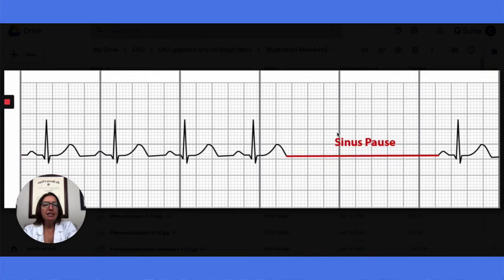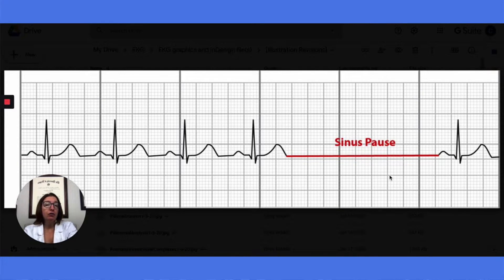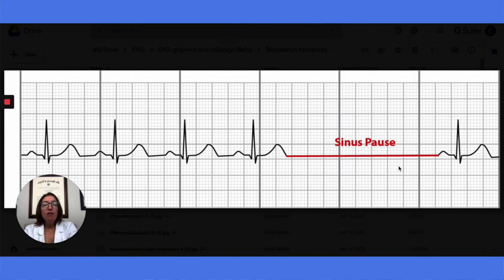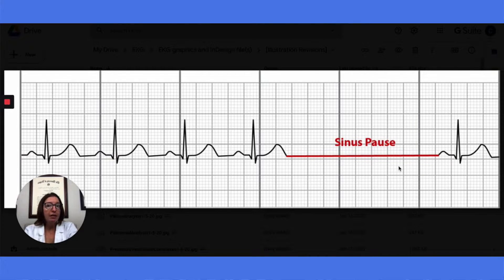Here we have a sinus pause, which is another EKG abnormality to be familiar with. A sinus pause is caused when the SA node fails to initiate an impulse, or that impulse somehow becomes blocked such that the atria do not depolarize. During the sinus pause, we will not have the P wave, QRS complex, or the T wave.